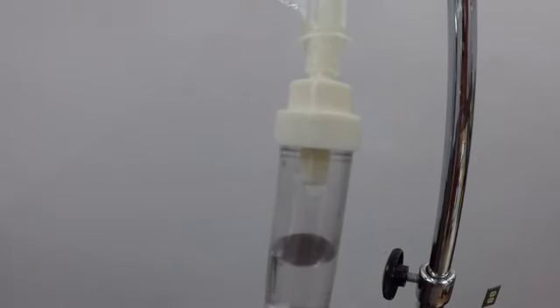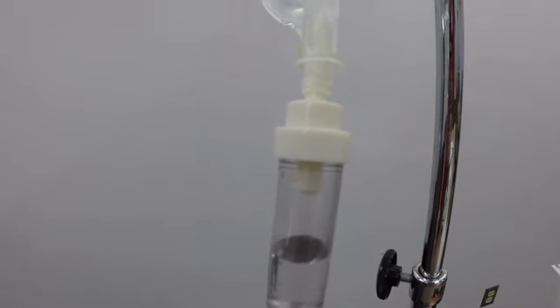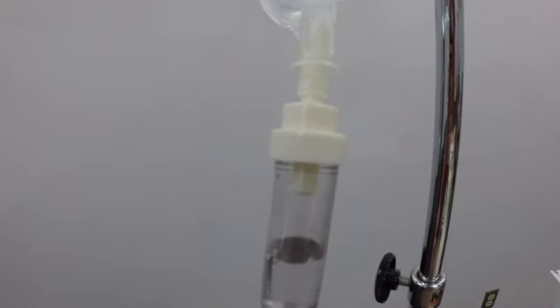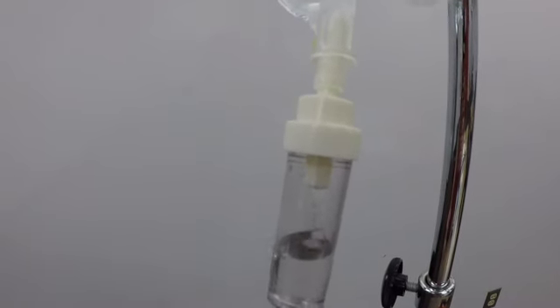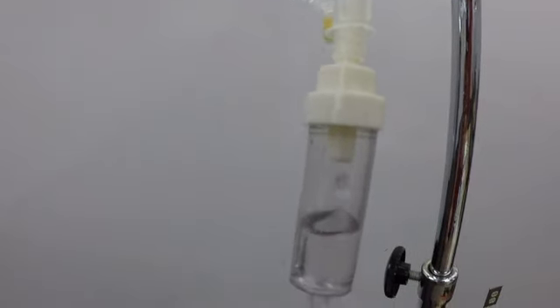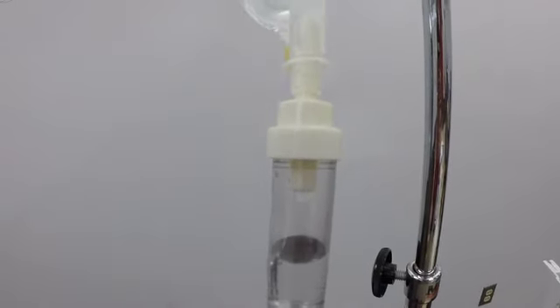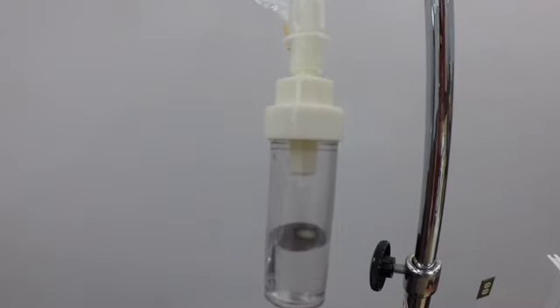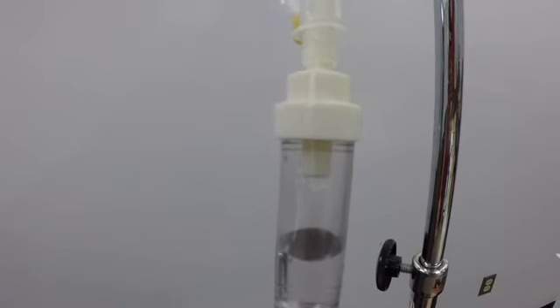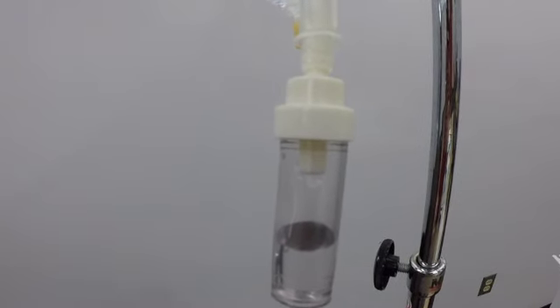I set the drip rate KVO, so say a drop every 10 seconds or so. And I give my medication, and now I'm going to open it up just because I want that medication to run in. And now I'm going to cut it back. I'm going to turn the chamber back to the keep vein open rate, which is about a drop. Whichever drip set you use, it's going to be a drop between 10 and 15 seconds.